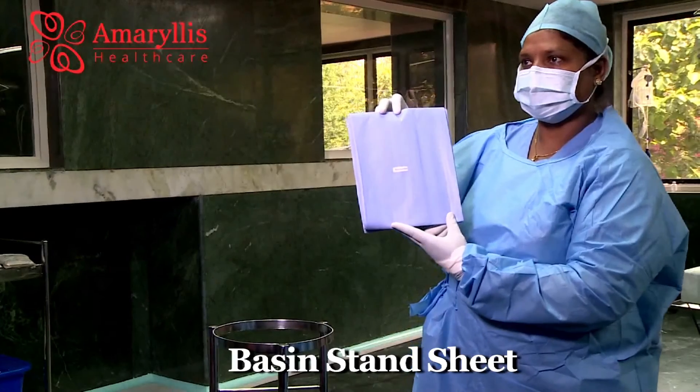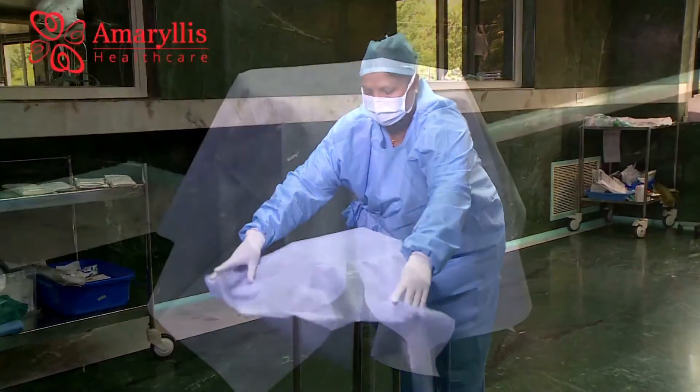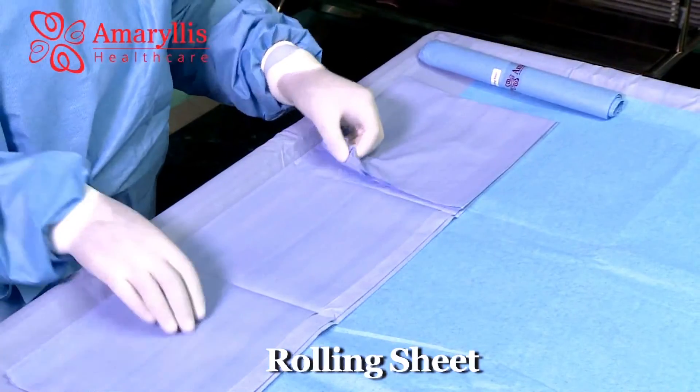The basin stand sheet is used to cover the basin stand. Minor surgical instruments are placed on the rolling sheet for easy access.